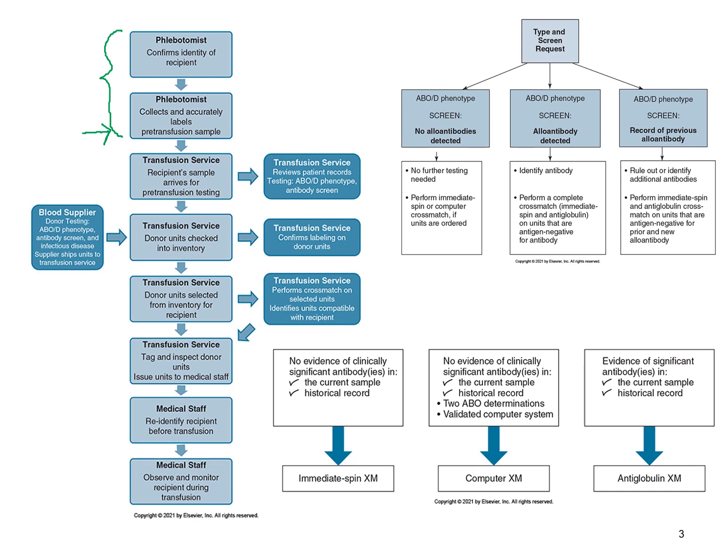Now, once that sample gets to transfusion services, they're responsible for the testing from that point on. So transfusion services will get the recipient's or the patient's sample to do the actual pre-transfusion testing. So once it is in the blood bank world or in transfusion services, however it's termed within your facility, they will go through several different processes. And those processes are going to include things like reviewing the patient records.